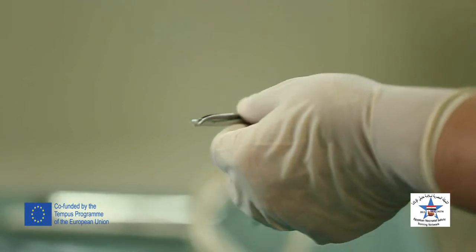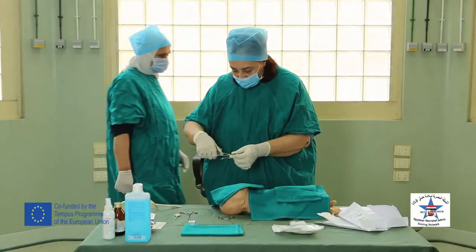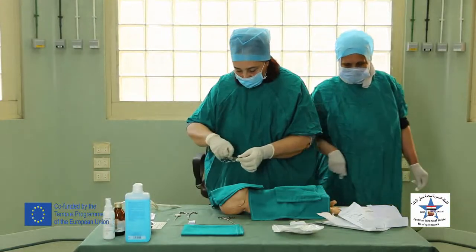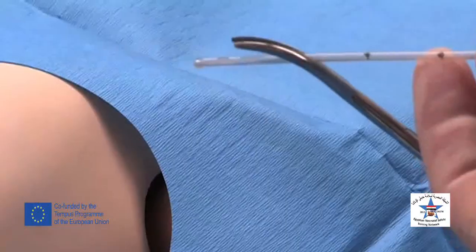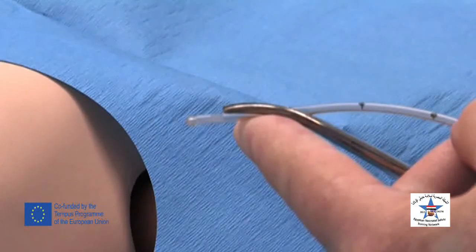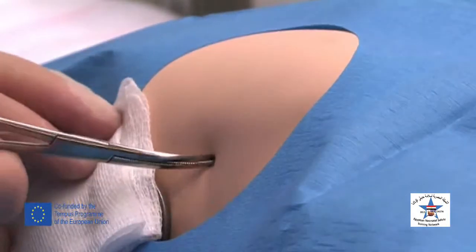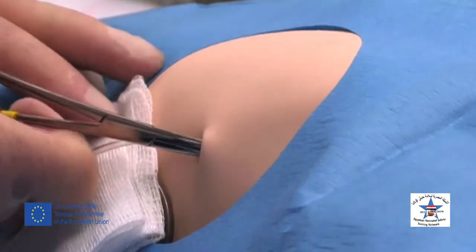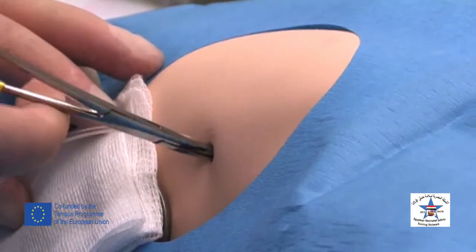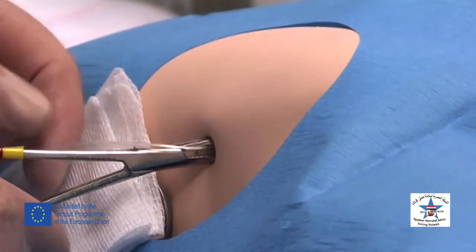The distal end of the chest tube I will close with a clamp and enter, guided by the finger, the incision I had made before until the chest tube is inside the pleural cavity. I will release my curved forceps and withdraw it, and I will support the chest tube in place.